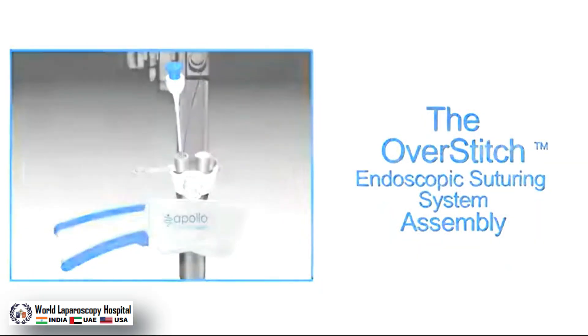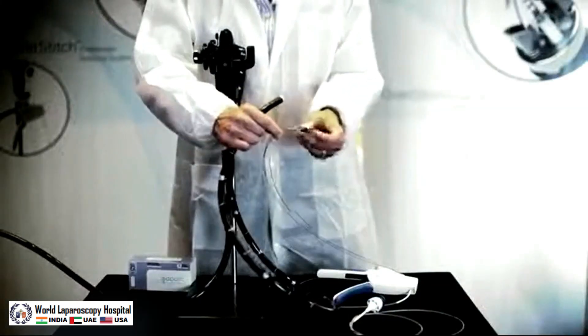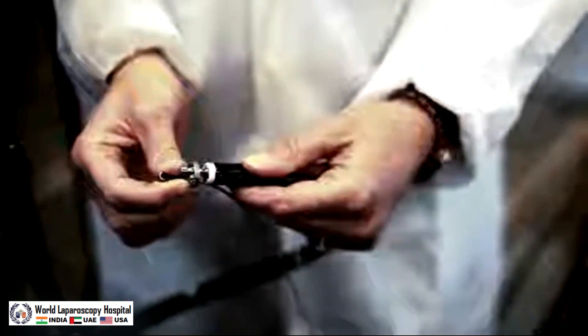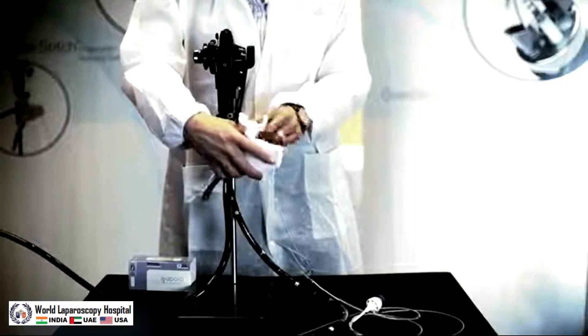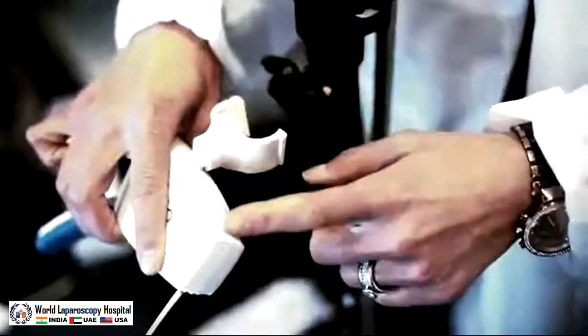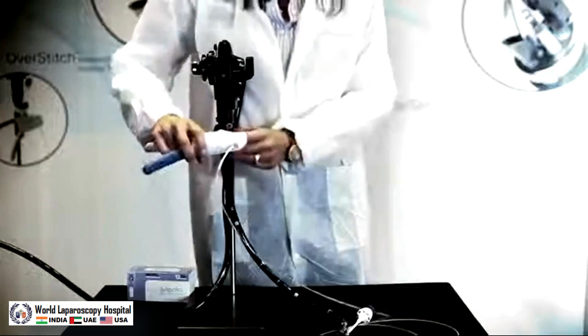We will begin by setting up the OverStitch suturing system. First, insert the alignment tube down the therapeutic channel of the gastroscope. Hold onto the edges of the end cap with the needle driver closed and slide it until it fully covers the end of the gastroscope. Next, take the needle driver handle and point the bracket at a 90-degree angle to the handle. Position the lip of the bracket adjacent to the biopsy channels and rock the handle down to lock onto the gastroscope.